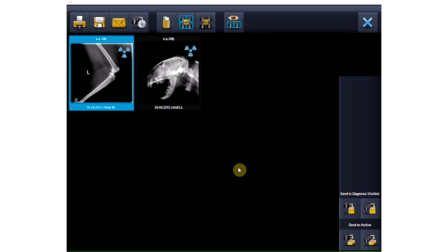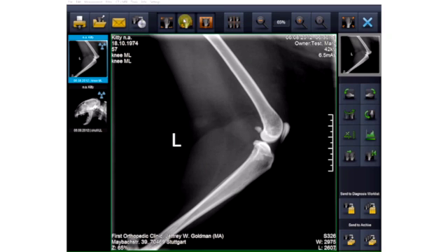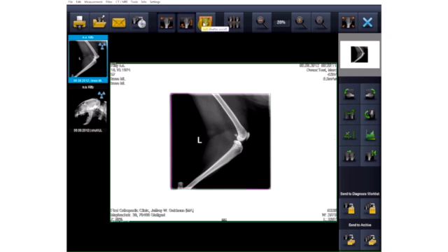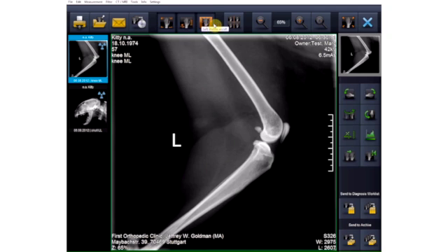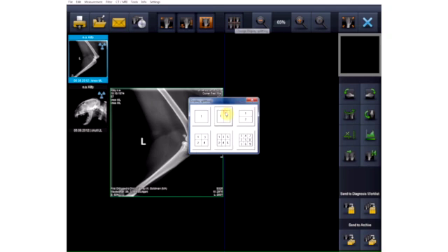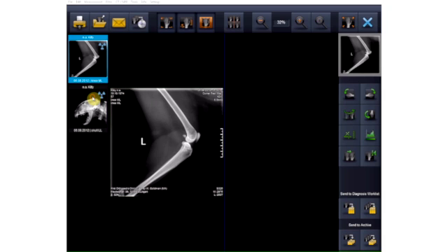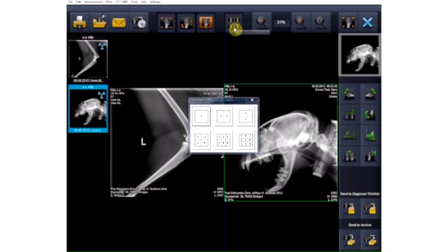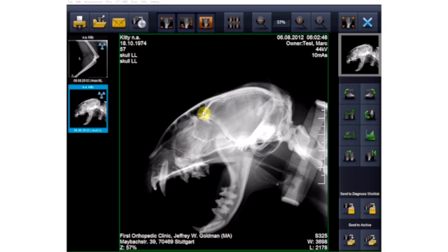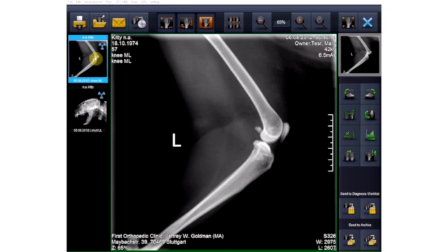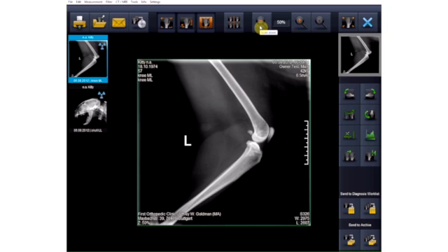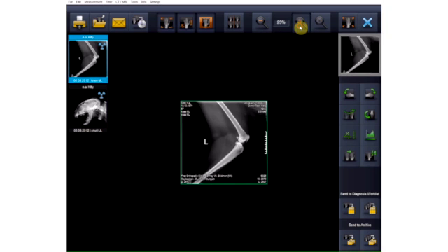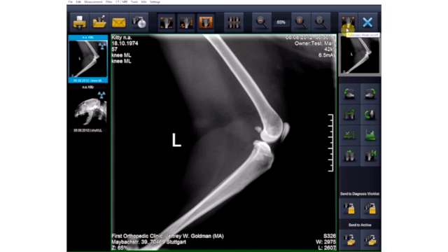In addition to the tools available in the overview screen, viewer mode offers you the following functions: turn data overlay on or off, take measurements, or activate and deactivate the shutter. You can change the display splitting, zoom images in and out, turn on full screen mode, and rotate and mirror images.